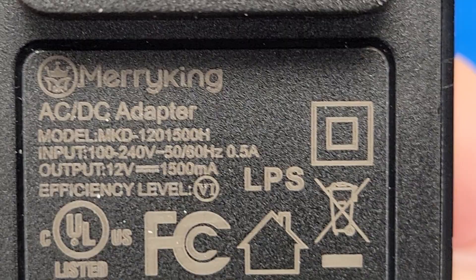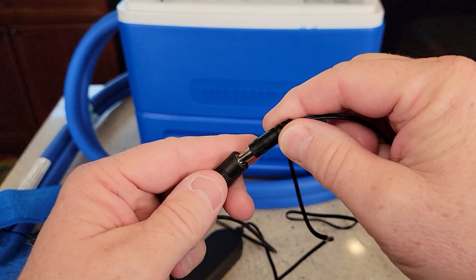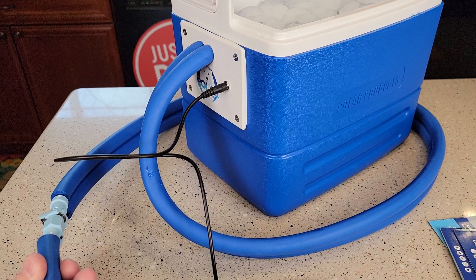So it comes with this power supply. You've got to plug this power supply in. There's the model number. Your input is 100 to 240 volts, 50 to 60 hertz. Output is 12 volts, 1500 milliamps. So you have to plug this into the controller — plug the output of the power supply into this controller. Now this controller has another line going out of it. The line going out the top of the controller, you're going to plug this into the actual cooler. There's a spot right here — you're going to plug that in.